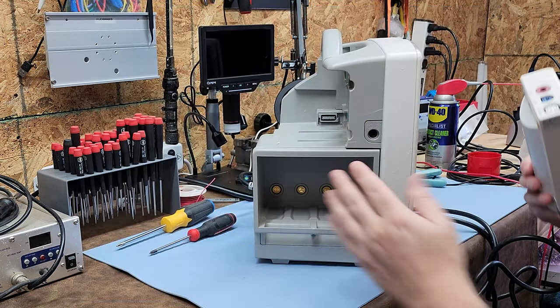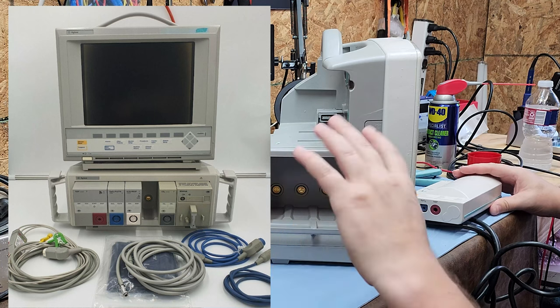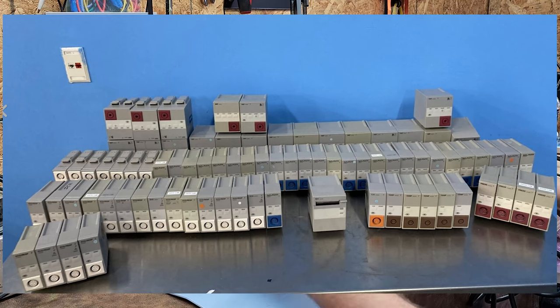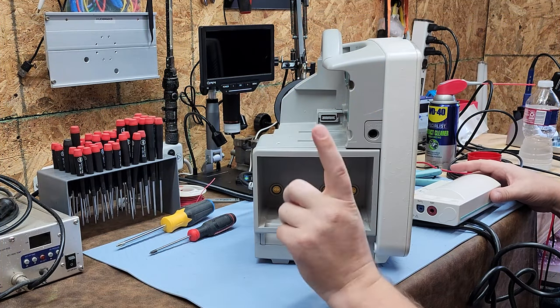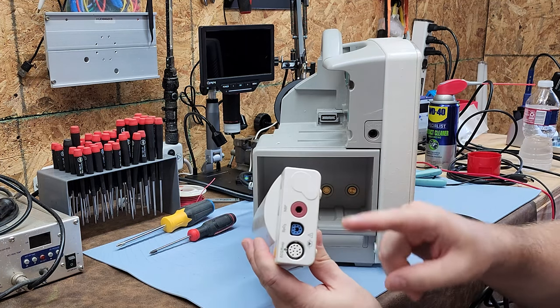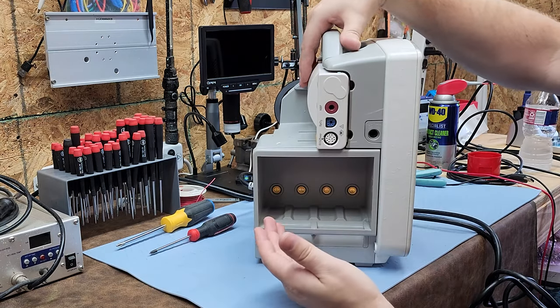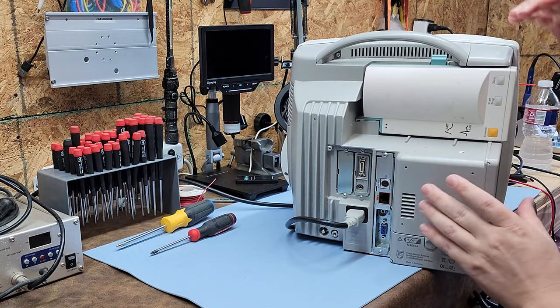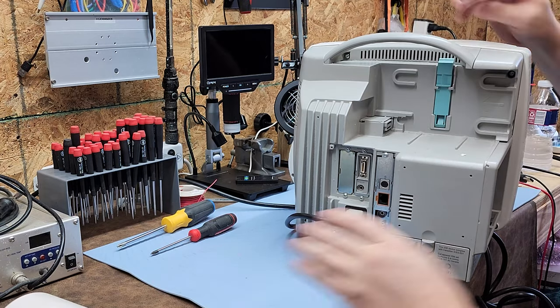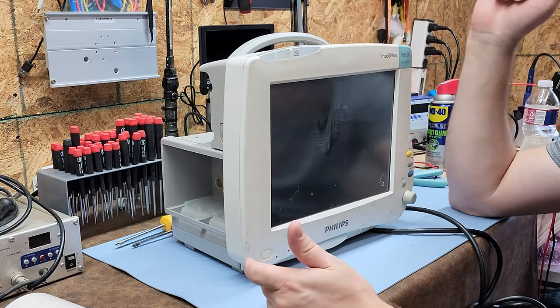This is the old system — I believe it was Hewlett Packard that originally had the bricks that plugged into a rack. I'll show still images so you can see what I mean. Then Philips came out with the MMS module, which consolidated multiple components into one device. It plugs in like so, and there's a lever at the top to release it.